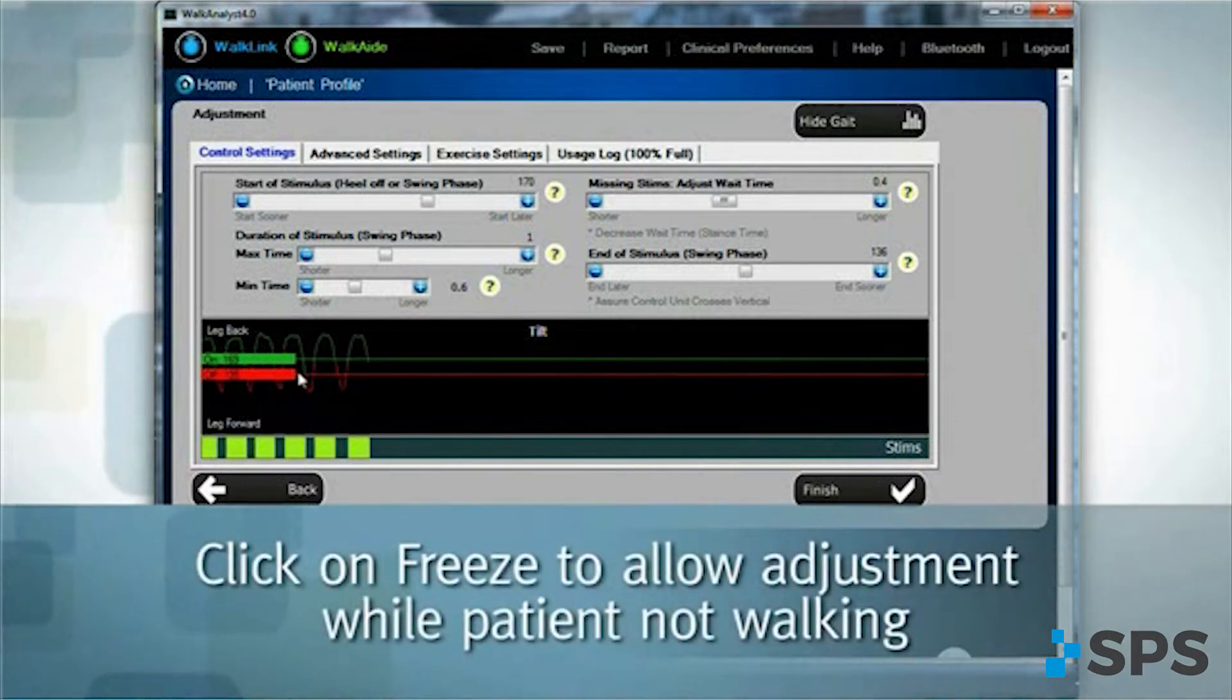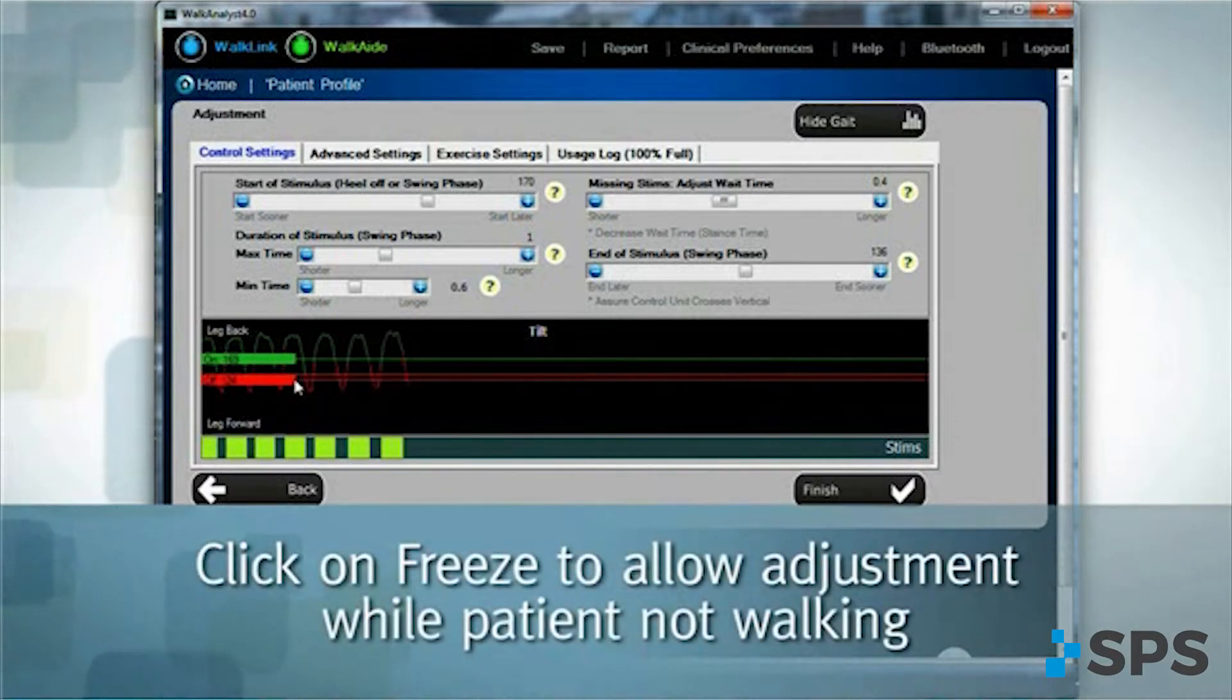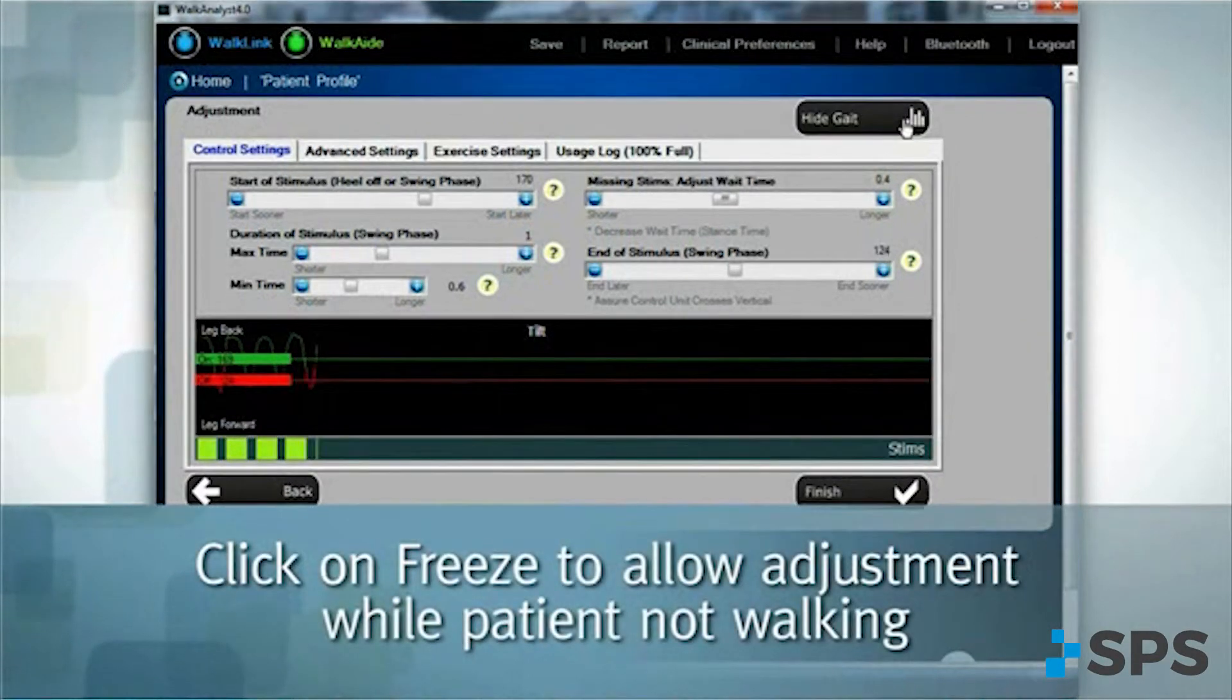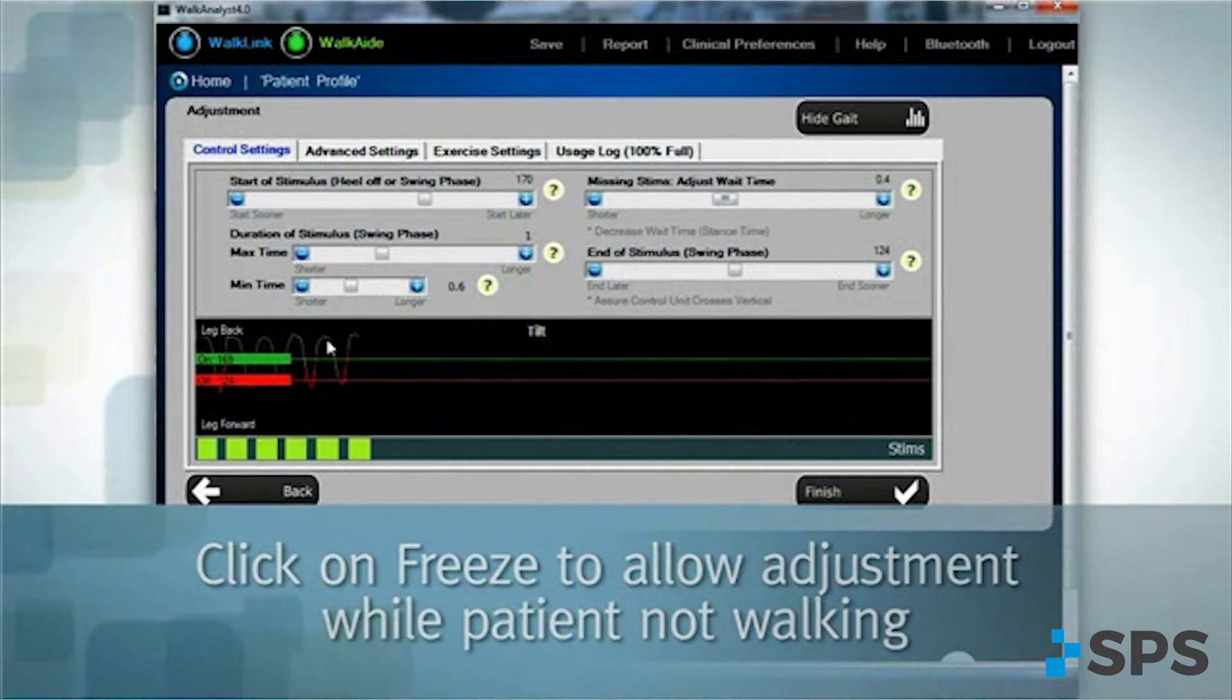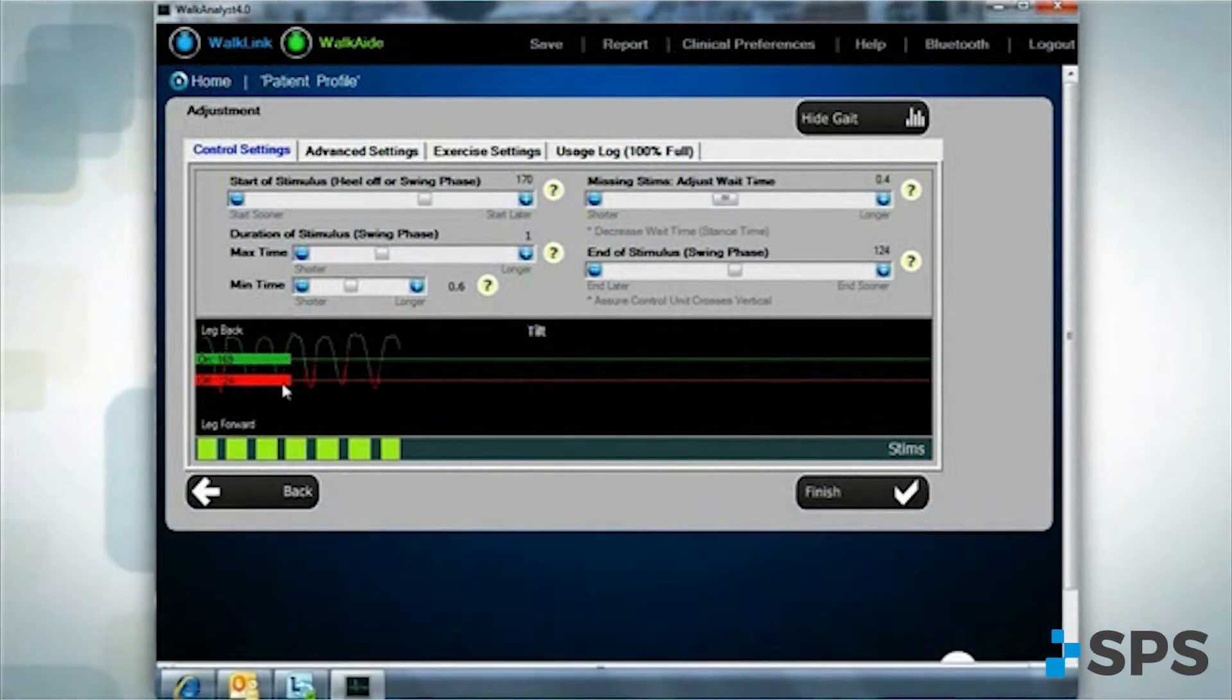If the stimulation stops too soon, lower the off threshold. If the stimulation stops too late, raise the off threshold.